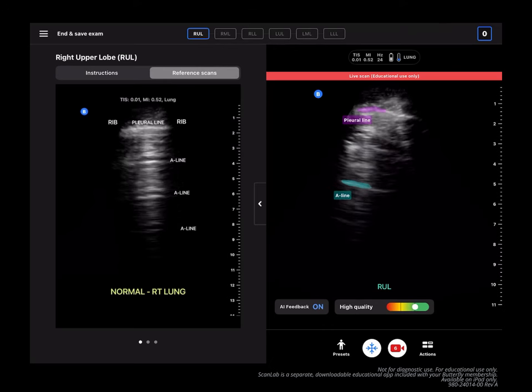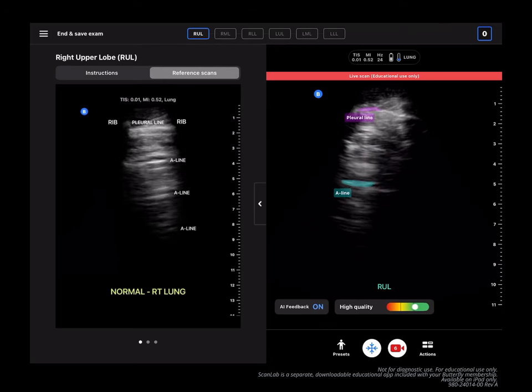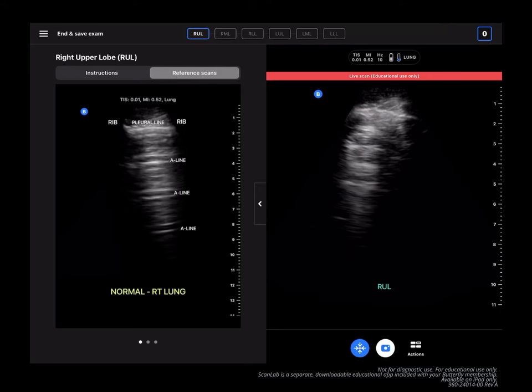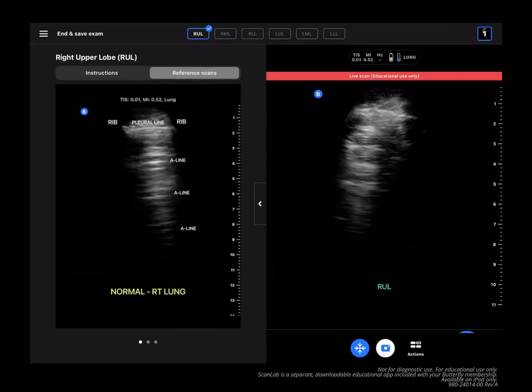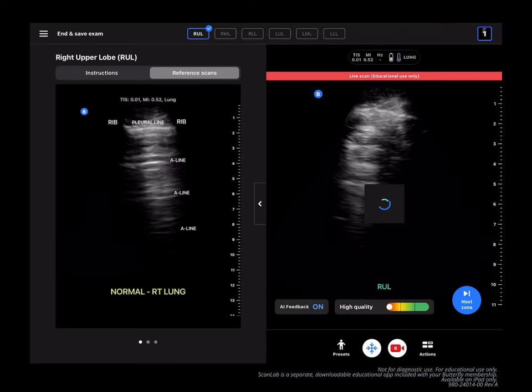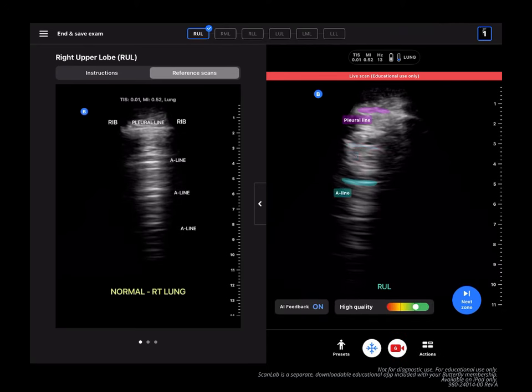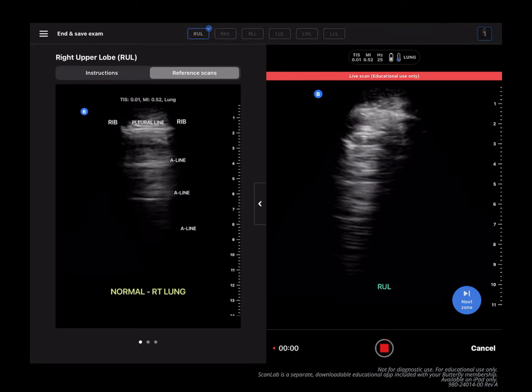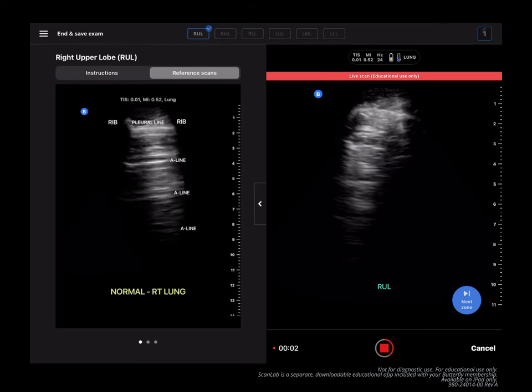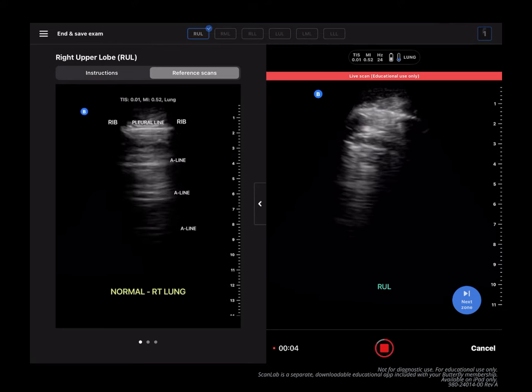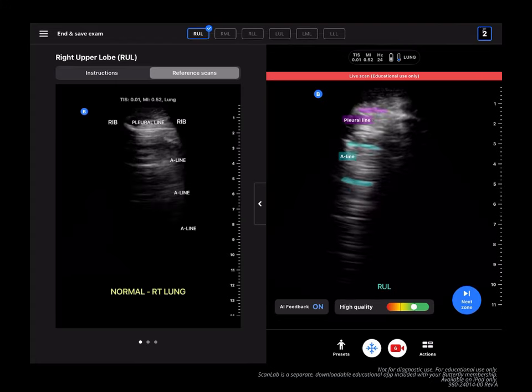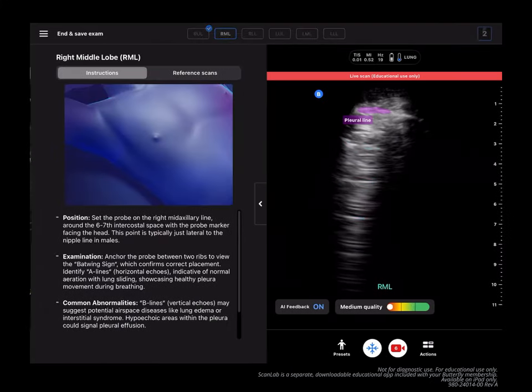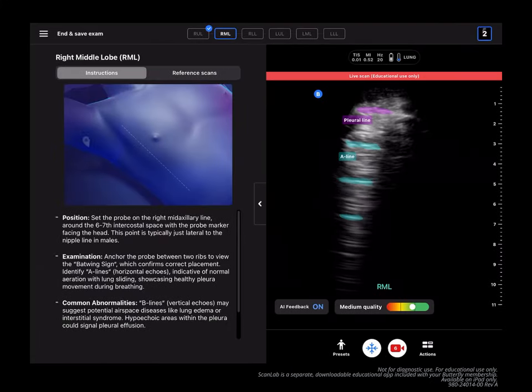When you're ready to capture your image, click the Freeze button and Capture. Or you can take a Cine by clicking the Record button during Live Scan. A blue circle will automatically pop up to guide you to the next view, and you can move through the rest of the views or skip through by clicking on the different views at the top.